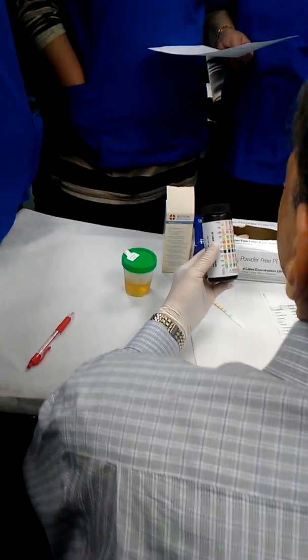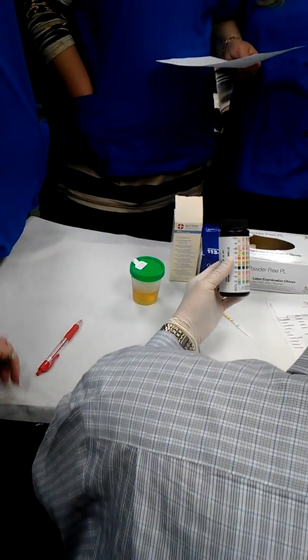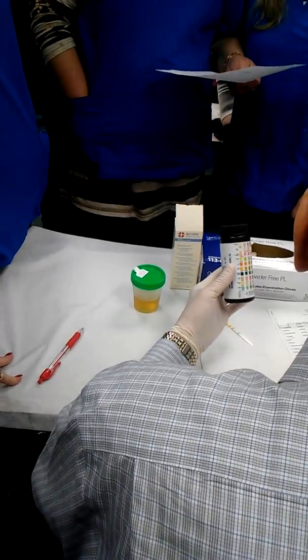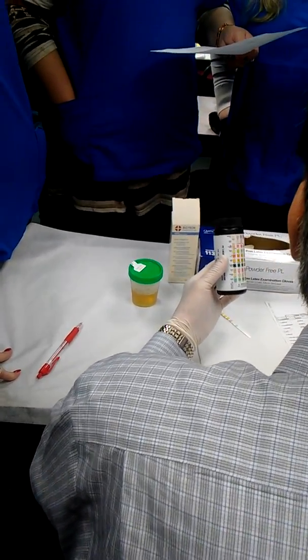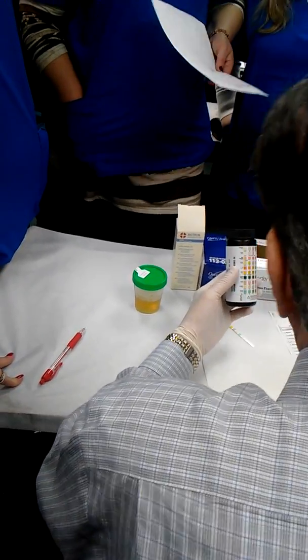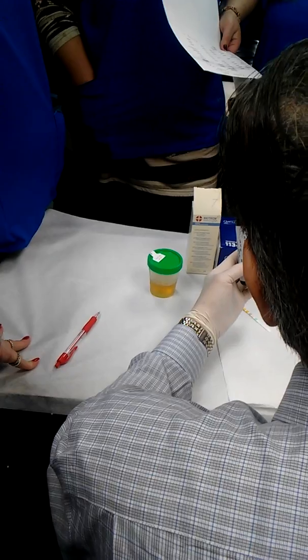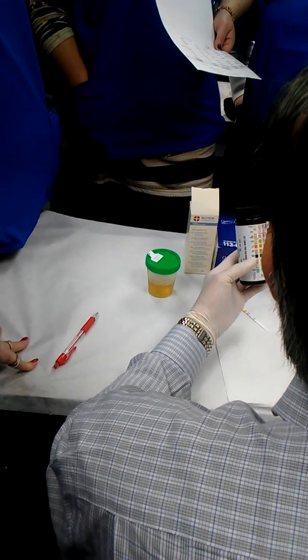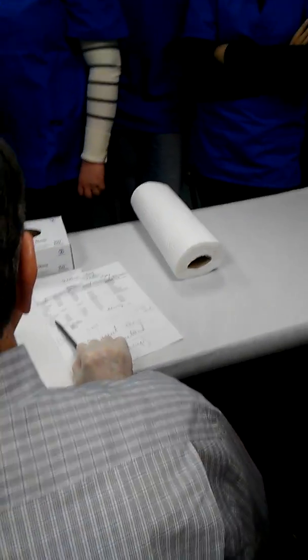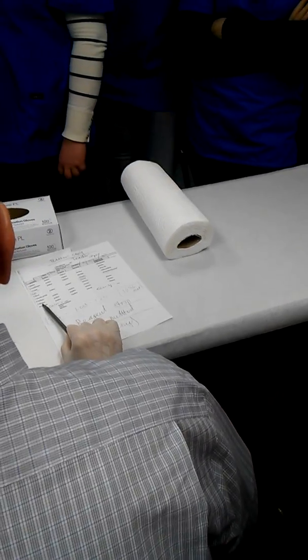If people develop complications, they will develop ketones. One of these ketones is acetone, по-русски ацетон. Another could be special bodies resembling the ketones, resembling the acetone, right? And they will be present in people having diabetes. If you see ketones in the urine, you have to send this patient immediately to the emergency room because it's a complication of diabetes. Next is bilirubin.